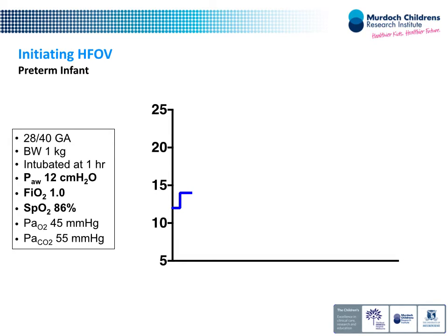And the Calgary guys have to keep quiet. If you have the chance to have an X-ray, it will be the best thing to show for us to see where we are. Who would do an X-ray before they put the baby on the oscillator? Makes sense. I would like to know what the conventional pulmonary mechanics were before, because if this were just pure pulmonary hypertension... No. So there's no pre and post ductal difference, and your compliance.